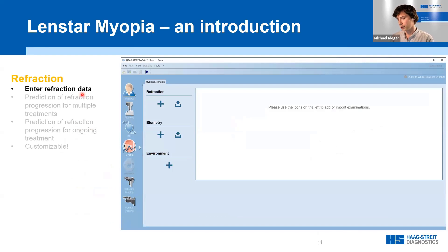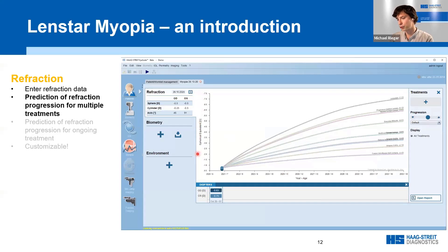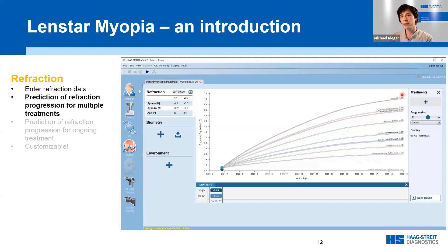In the refraction section, data are entered. You can specify the measurement method — whether it was cycloplegic or not — and enter the sphere, cylinder, and axis. Once data is added, you get a graph with spherical equivalent on the y-axis and patient age on the x-axis. For example, a patient almost seven years old already at minus 0.5 diopters. The software provides a prediction curve showing how the spherical equivalent would change over time until adulthood — untreated, this would result in minus 7.1 diopters.